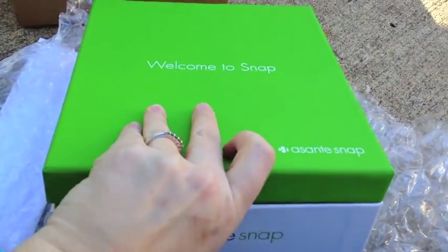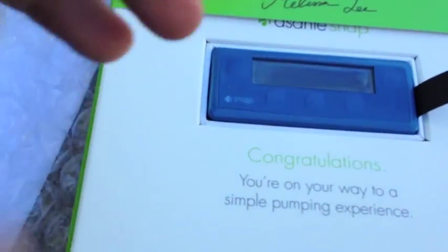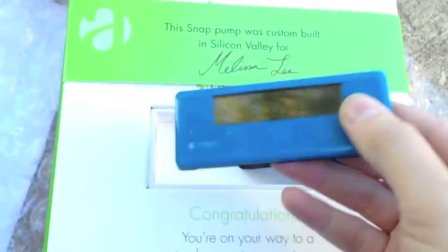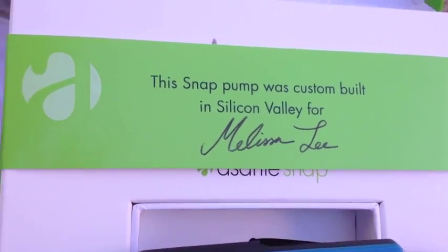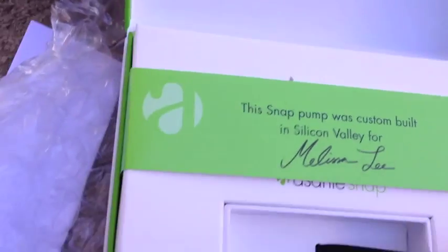So here we go, we have this lovely green and white box and this is my new snap controller. This snap pump was custom built in Silicon Valley for Melissa Lee — that's actually my signature. That's pretty clever.